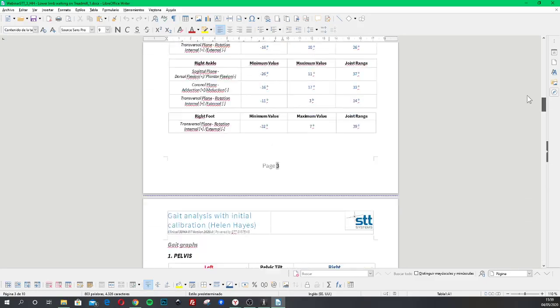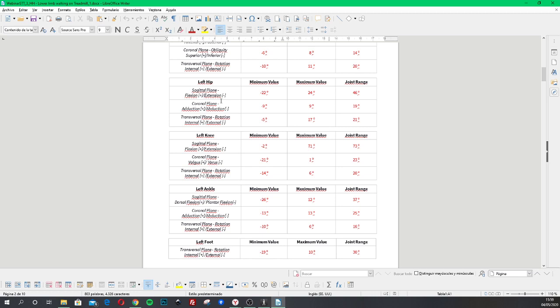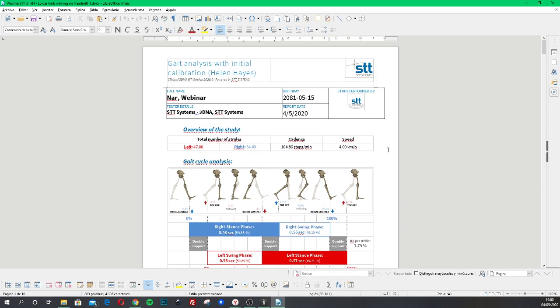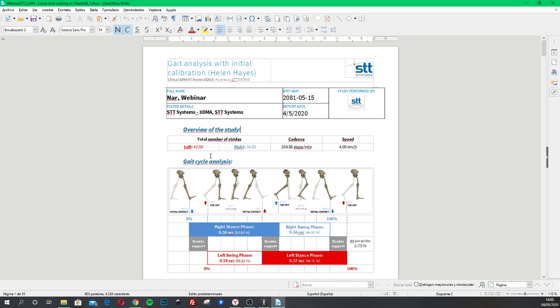But if you want to print it out or explain to someone just the main tips, maybe you prefer a more summarized or more compact one, or even just because your company has all the colors in green, you prefer to have your report in green as well, not only your logo but the labels and these parts. Okay, how to do this? Let's minimize this. This is the original one, okay? So let's minimize it and find where the original templates are.